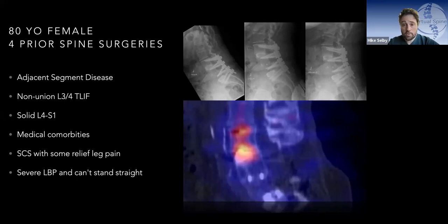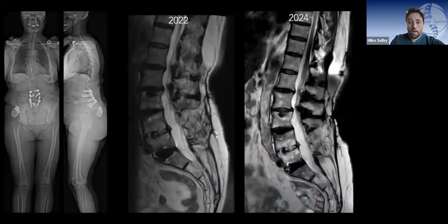It's also helpful assessing patients for adjacent segment disease, sacral iliac joint pathology, and other potential pain generators. You don't have to rely purely on a bone scan. You can then use your diagnostic blocks, local anesthetic, and see how a patient responds to those. But to me, this is a very important modality, and I hang my head in shame because when I wrote my JS review paper on this in 2012, I barely mentioned, or I don't think I even mentioned bone scan with SPECT. So I really should have. And I use it a lot now in my day-to-day practice, which is heavily revision focused.